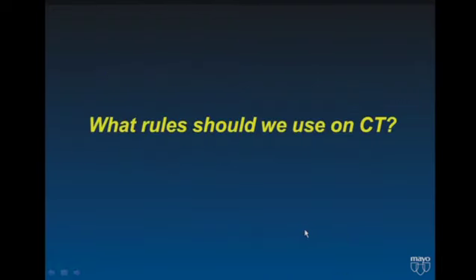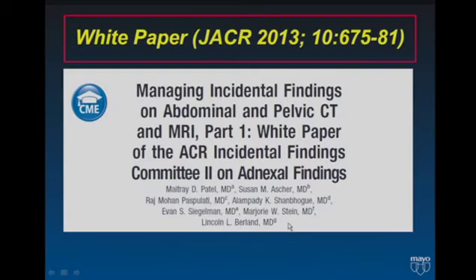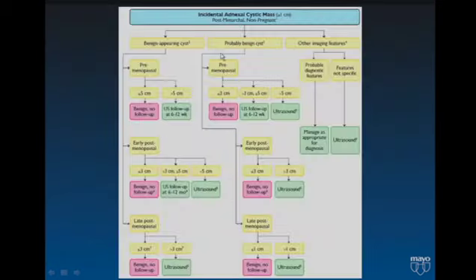Now, what rules should we be using on CT? Well, this was recently articulated in a paper that was published in the Journal of the American College of Radiology, so I would refer you to go look at that article, but we're going to talk about it in brief. And this is the algorithm that has been described that I will be going over really briefly in the next few slides.